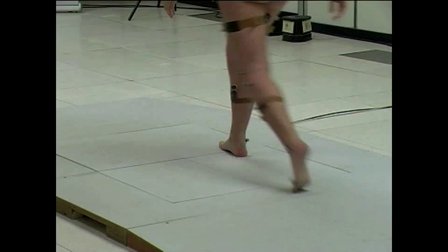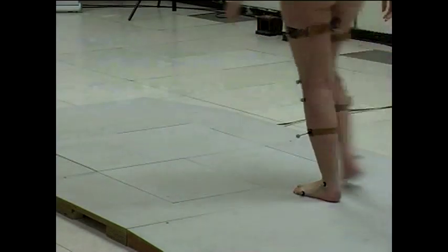But thanks to the BTS P6000 platform technology, you can also consider a trial as a good walking trial when the patient performs a foot stance phase between two closed platforms. Only if the 2 feet are in contact on one platform at the same time, or if the foot stance phase is not completely performed inside the platform, the trial has to be discarded.